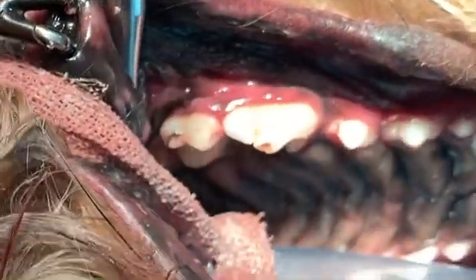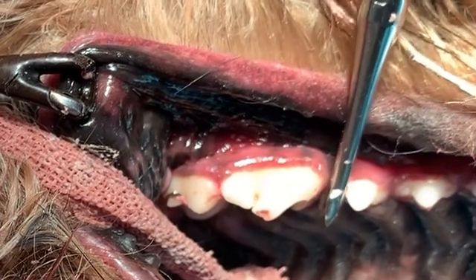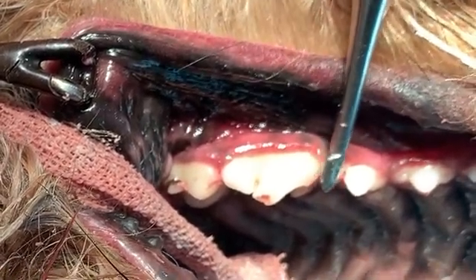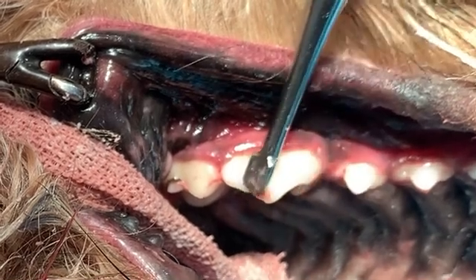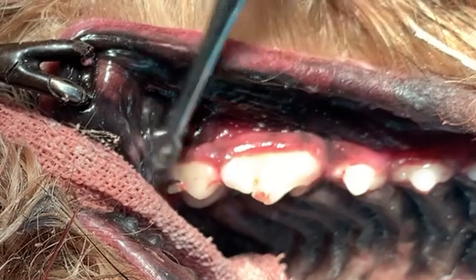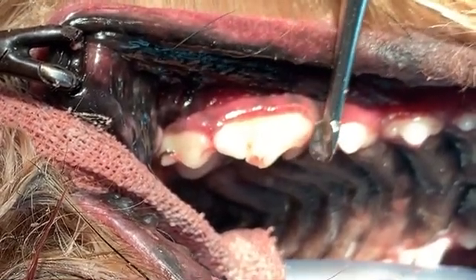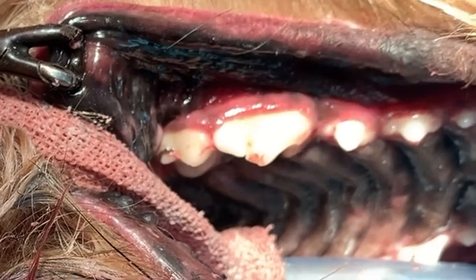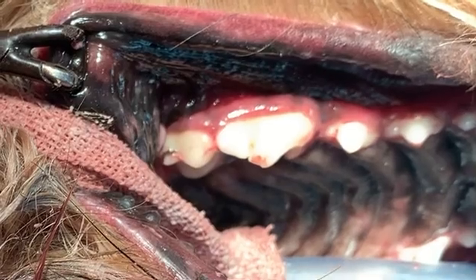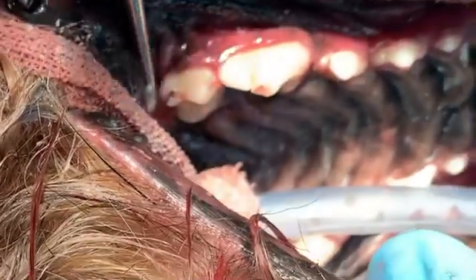So what I'm doing — and I won't actually do it right now — is putting the elevator in this direction and then twisting like this, getting some leverage against this tooth. What we'll do is actually roll that tooth out eventually. We'll apply pressure until you notice a little bit of bleeding around it, release for a second to let the blood well up underneath the tooth and provide a little bit of elevation, and then do it again.